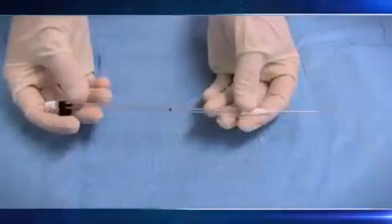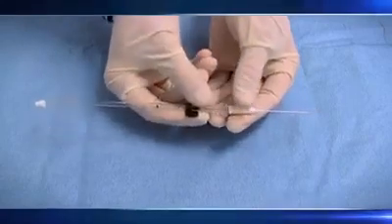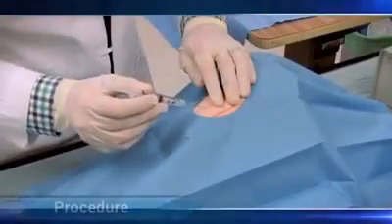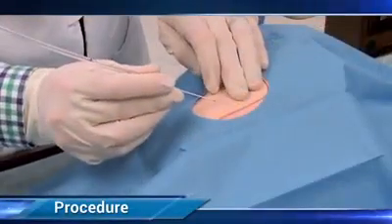We will first demonstrate radial artery catheterization with the modified Seldinger technique, which uses the catheter over a needle that is guided with a built-in wire. Always use lidocaine in a conscious patient. Point the bevel facing up.